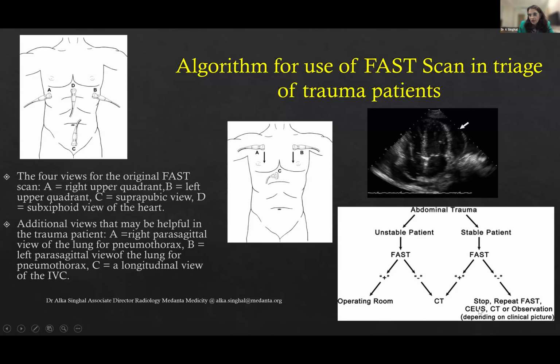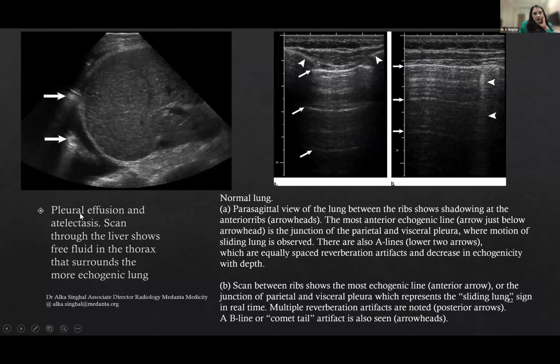Again, stable patient, depending on the clinical picture, you can observe, or CT, or contrast ultrasound if there's a subtle trauma or a laceration, which is not so obvious on routine ultrasound. It can be picked up on contrast or a CT, depending on the clinical picture. And of course, these are the other findings.